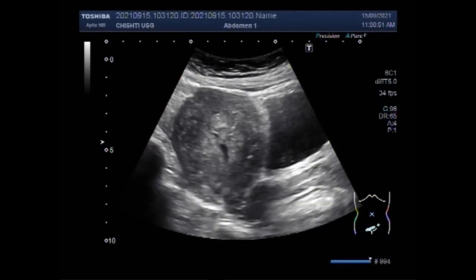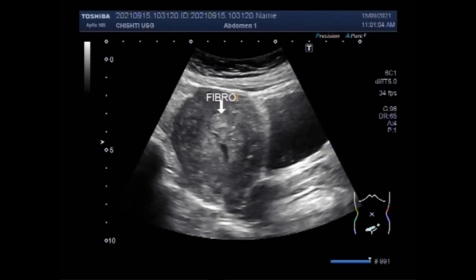These fibroids can be all sizes, from as small as a millimeter to as large as a basketball. Submucosal fibroids located inside the uterus can deform the cavity there. You can see the pedunculated submucosal fibroid is seen in the distal portion of the uterine cavity.